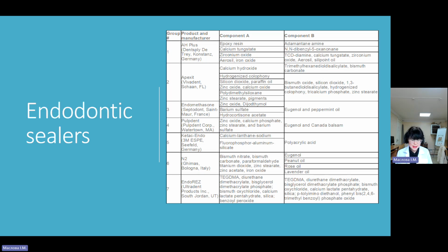Initial research reported the sealer set leaving a working time of just 60 seconds. Considering the time needed to transport the sealer to the root canal system, this resulted in radiographically detectable voids in the resultant root filling.